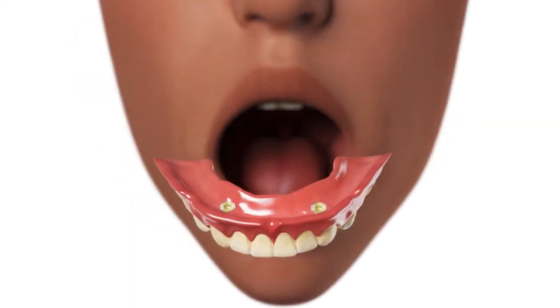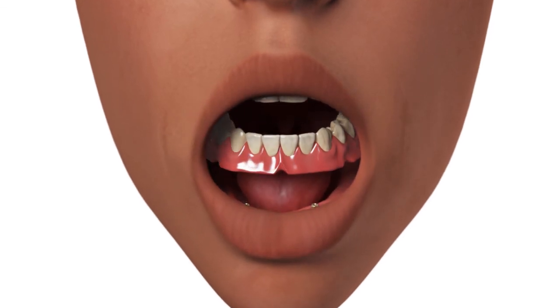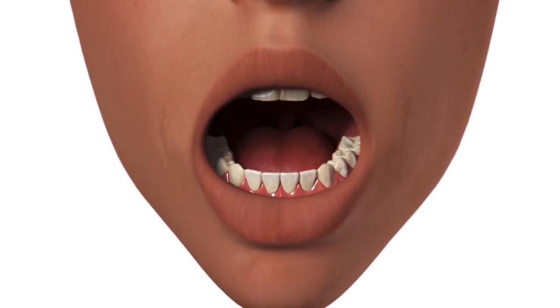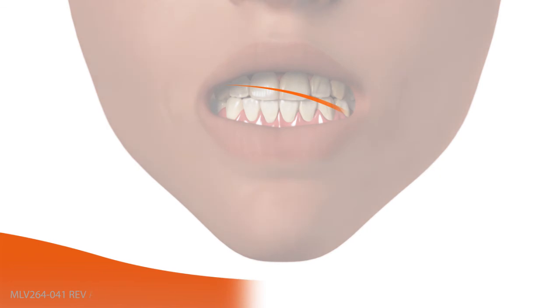Seat the overdenture onto the OD Secure abutments and modify the occlusion as necessary. Verify the patient's ability to remove and seat the denture properly. If the denture has too much or too little retention, select an insert with a different retention.